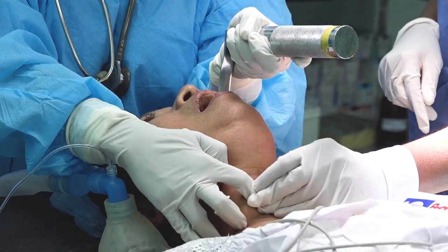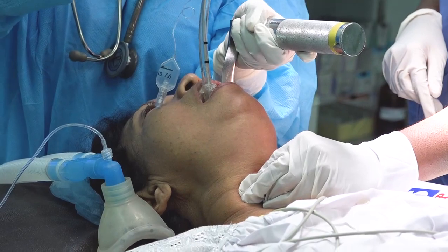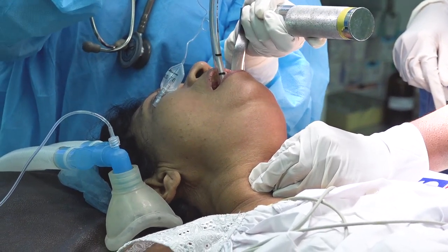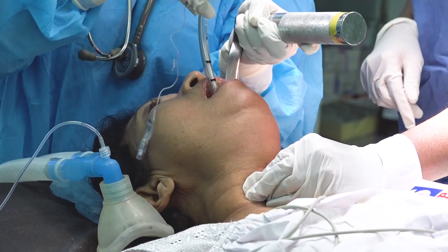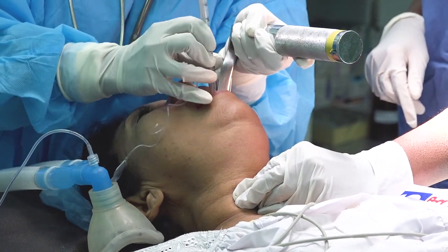So now if you have tried about twice and if you find it difficult to intubate, now is the time to do some modification to your technique. So one of the first things that you can do is to pass an endotracheal tube stylet through the endotracheal tube and then reattempt at intubation.